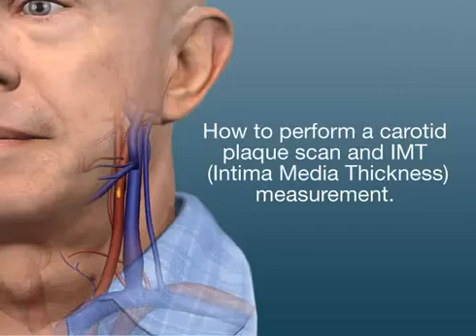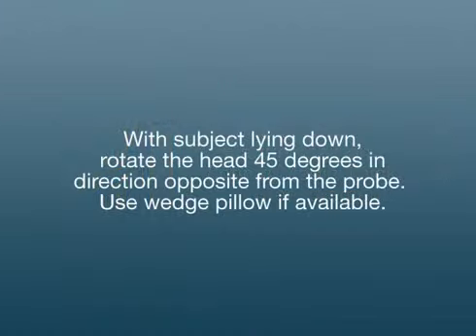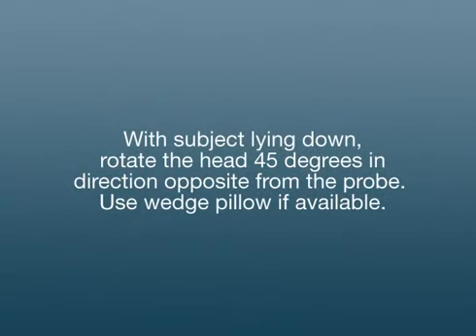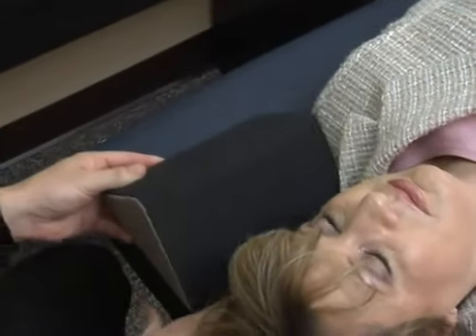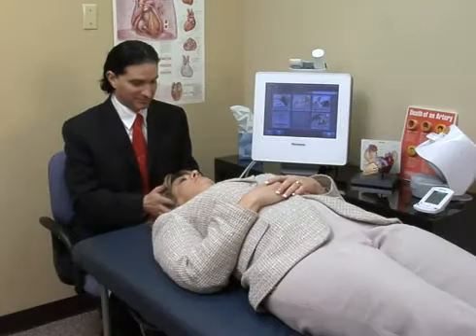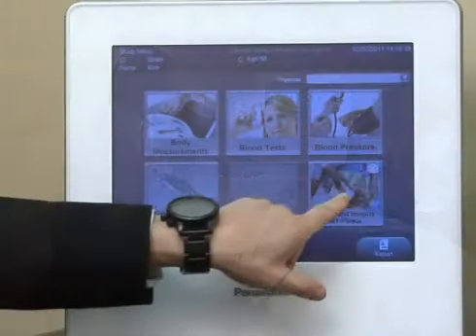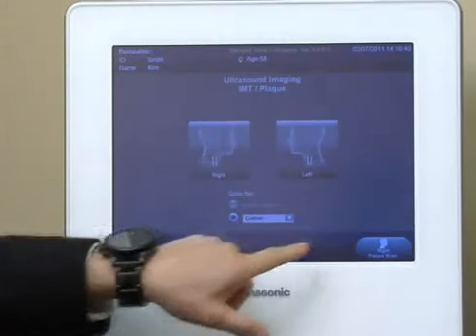In order to perform a carotid intima media thickness, or CIMT scan properly, have the patient lay flat on their back in a comfortable position with the patient's head rotated at a 45-degree angle. Begin the study on the right side first.